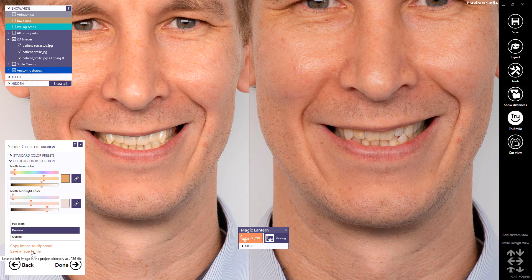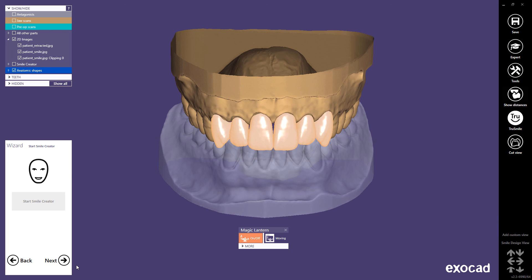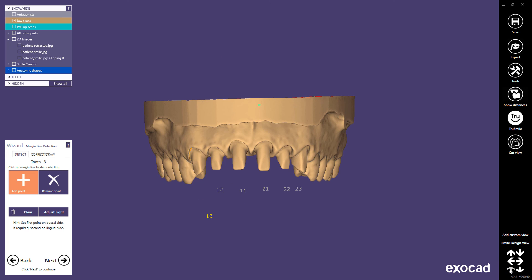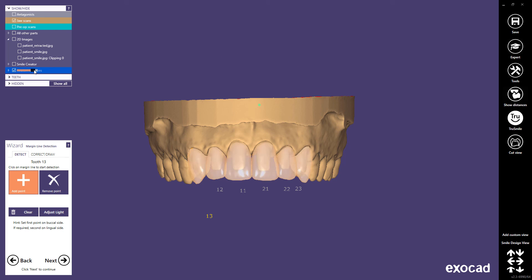Note, the true smile rendering of the teeth is not supported by WebView or 3D PDF. Select Done to finish the smile planning. You can now proceed to design your restorations based on the Smile Creator — this will be shown in a separate video. Smile Design View in Custom View will help you to bring back the exact viewpoint you had during the smile design, and can be selected at any time during the following design.